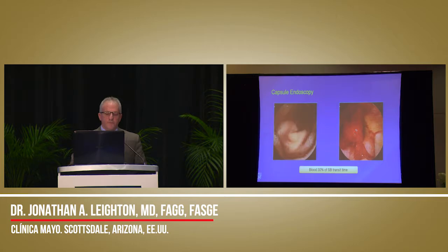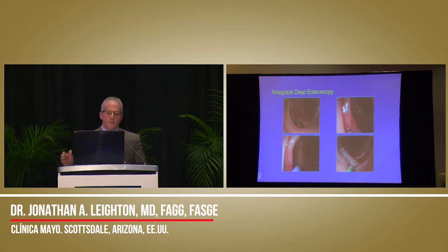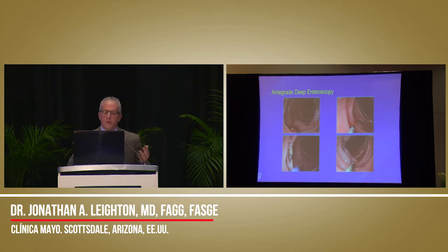And again, it did not show a specific lesion. But when we were able to go down with deep enteroscopy, and hopefully we can get this to kick in, you can see that we did find, at the time that we went down, an adherent clot. What we do in those situations is we first inject with 1 to 10,000 epinephrine, and then typically we'll use APC to treat the lesion. And then after we feel that we've gotten good hemostasis, then we always tattoo the lesion in case we have to go back down. So again, you get the sense that capsule and deep enteroscopy can work very nicely together.